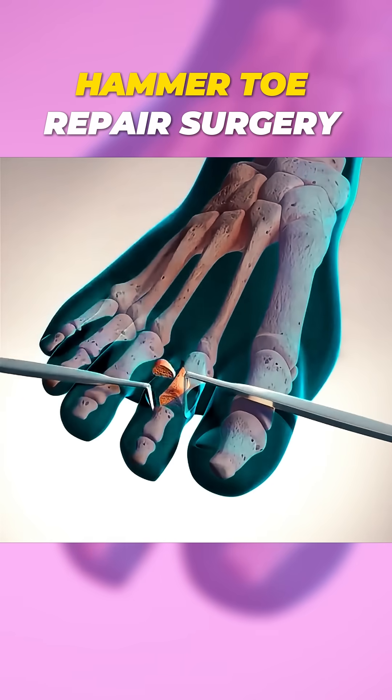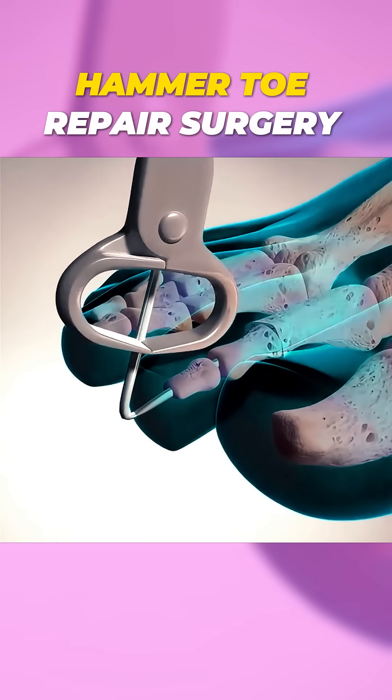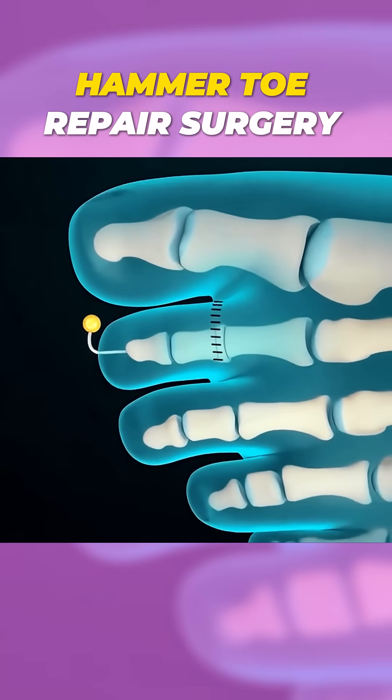In some cases, the surgeon will remove part of the bone or realign it to straighten the toe. If necessary, a small pin or screw is used to hold the bones in place while they heal. After everything is adjusted, the surgeon stitches up the incision.